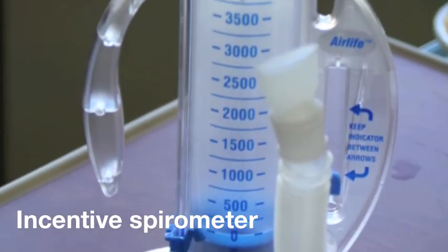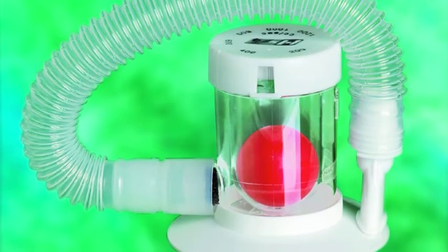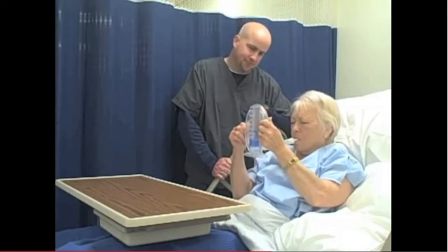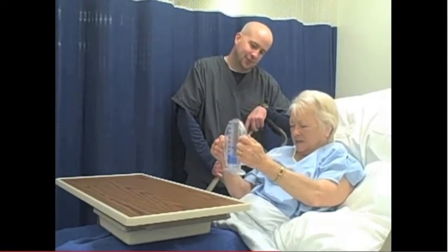This is an incentive spirometer. This type of spirometer is used by inhaling into the device. It can monitor flow and measure the amount of air moved. It's commonly used by people who need to exercise their lungs, like post-operative patients that might not want to breathe deeply because it's painful at first.